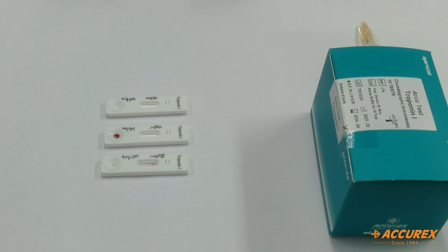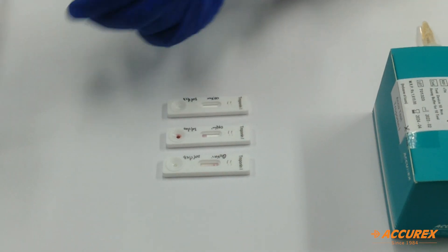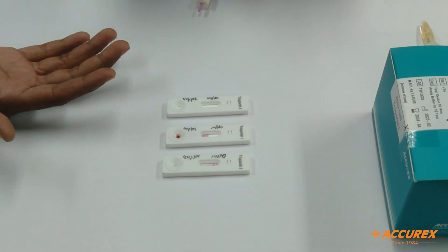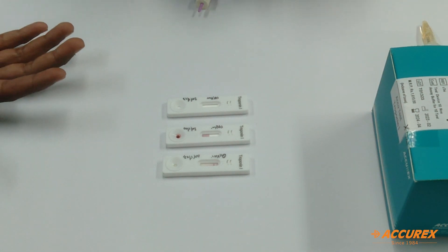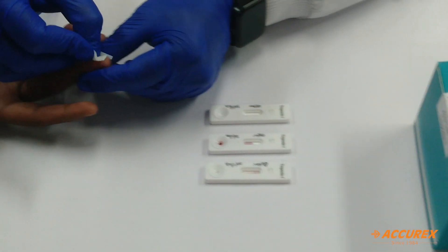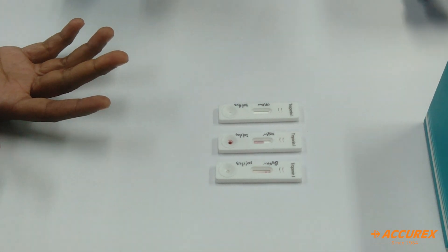Next we will try with finger prick sample. For finger prick sample, first we will clean the surface area of the finger properly with the alcohol swab. Allow it to dry for some time, then we will prick.